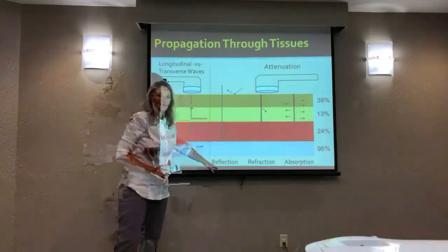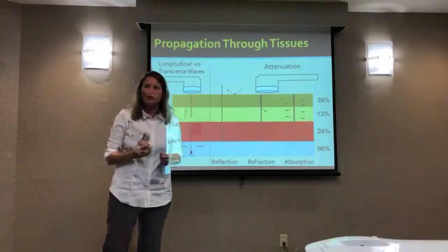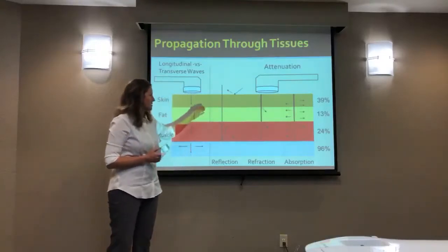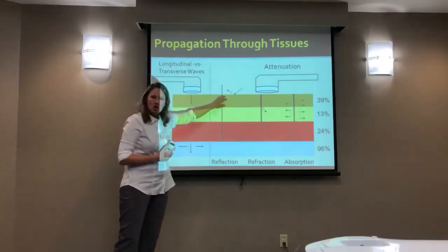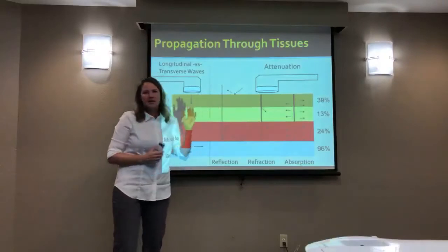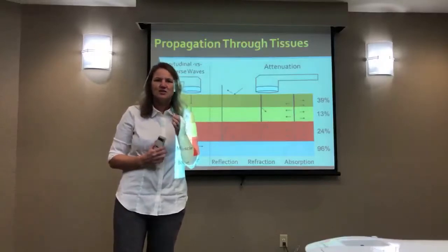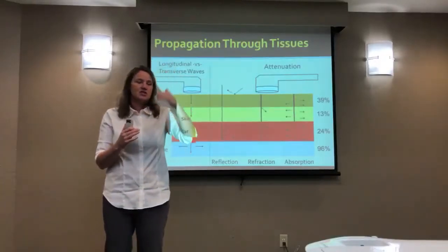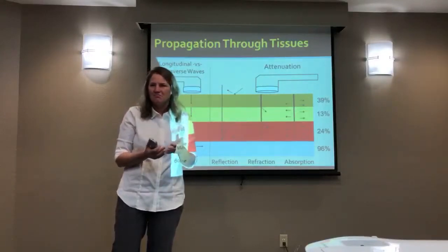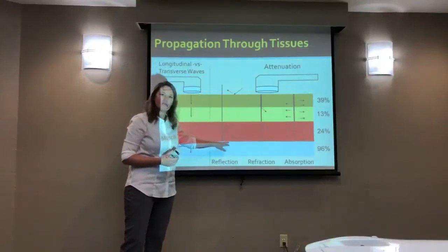One is reflection. So reflection is going to happen when there's a significant change in density. And think of it again as any reflective surface that would, if your voice would reflect off of it, same idea, it's going to reflect. The most common place this happens is scarred, thick, calloused, dry skin. So the level of the skin, if your coupling medium doesn't help transmit it, or if the tissue is just too thick, acts more like a solid, the energy is going to bounce right off and it will not enter. So sometimes you have a site that you would like to ultrasound, but it's not a realistic target because you really can't penetrate.